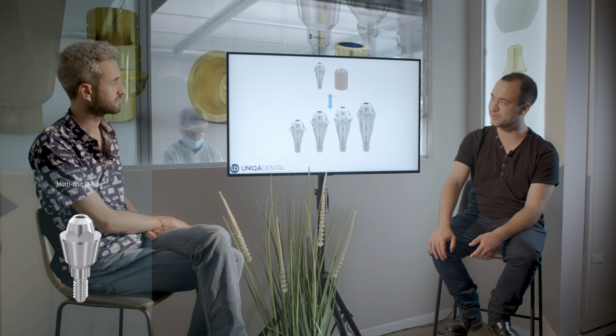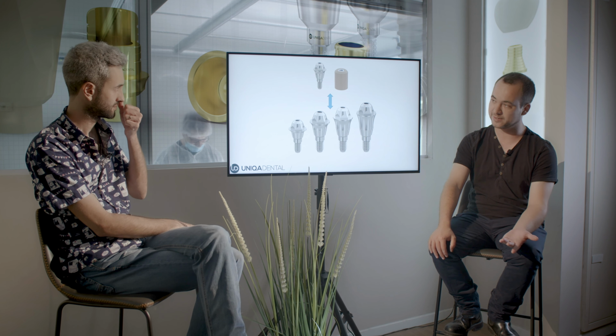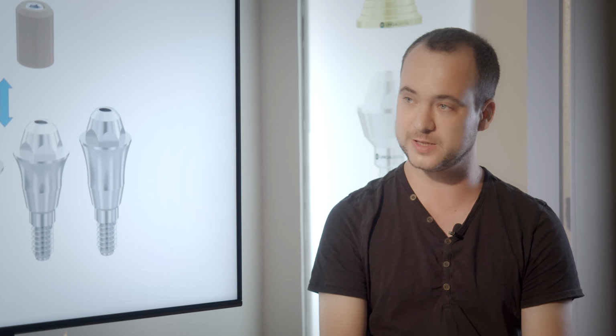When you take impressions on one type of multi-unit, for example, this 2 millimeter multi-unit, you know that the height between the base of the scan abutment and the implant is 2 millimeters. You can change it digitally to 1 or 3 and 4. The only problem is that you need to know the original height of the multi-unit you used.